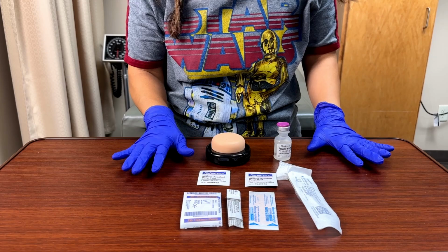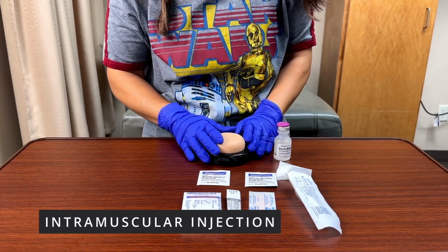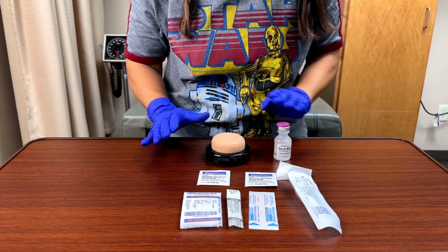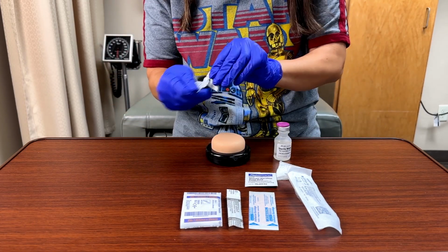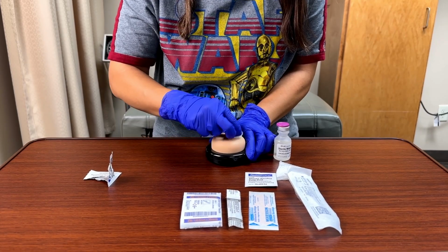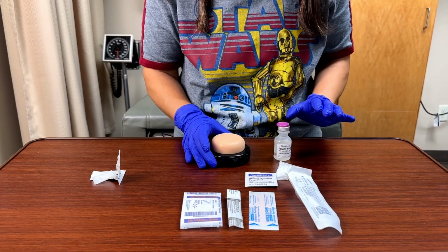All right, now let's get ready to do this intramuscular injection. We have our patient's skin, usually a deltoid, a shoulder, or a gluteal region. We've already inspected it, made sure it was good to go. We're going to clean the skin. For this, we'll open up a sterile pad, and we can do a side-to-side motion like this. You don't want to blow on it, you just let it dry naturally.